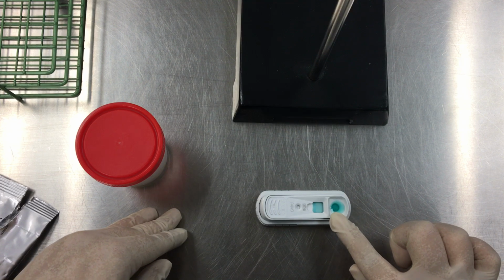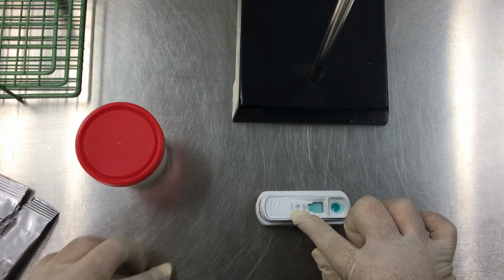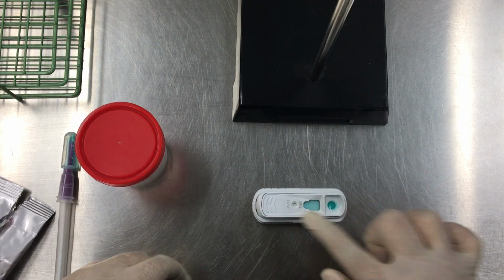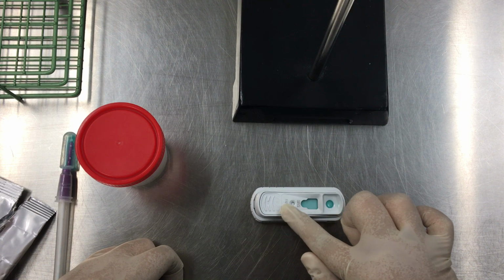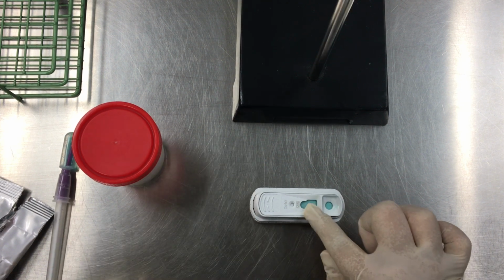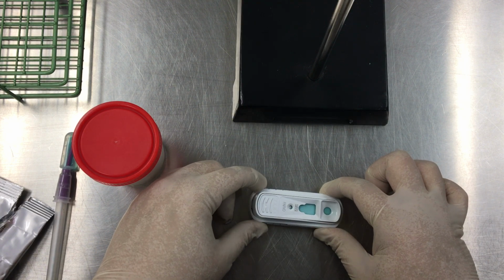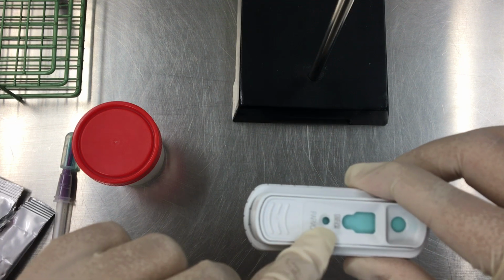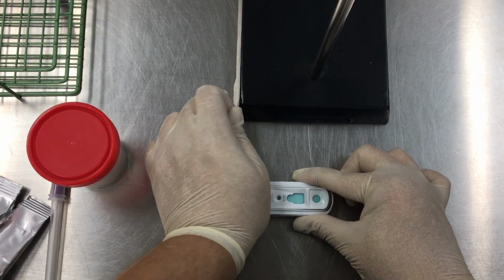Now once the sample fills the test window and appears in the activation circle, that's when I can snap the test. If it fills the test window and doesn't appear in the activation circle within 60 seconds, you can go ahead and snap the test. But if it doesn't fill this test window, you need to discard the test and get a new one and start over. So you can see that it's appeared in the activation circle, so I'm going to use the butt of my hand to snap the test.